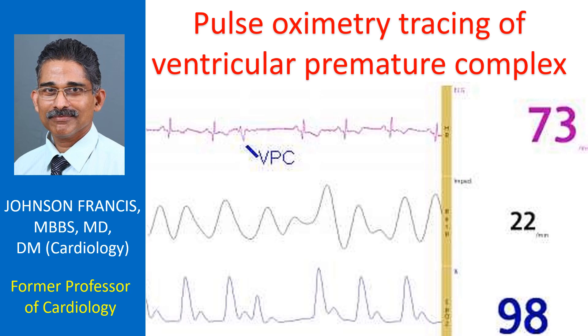Monitor screenshot showing ECG, respiration by thoracic impedance and pulse oximetry waveform. The upper tracing shows an ECG at rate of 73 per minute.